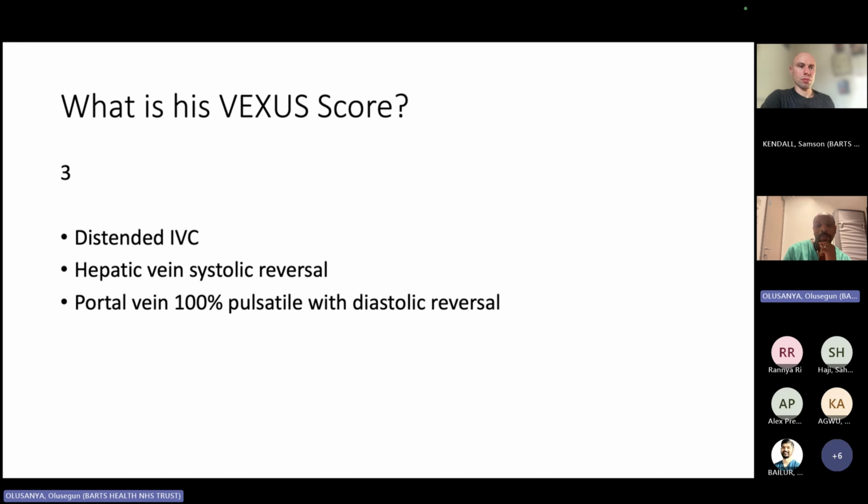Yeah, I mean, yes, definitely some of the views, especially in some of the intubated patients or bigger patients. Yeah, it can be quite hard to get, especially the renal, as you've put there. So in expert hands, this is William Beaubien-Souligny, who has basically written half his PhD on VExUS and wrote the paper. Him and André can get renal views in 75% of the patients. So you can expect to fail at full VExUS in a quarter of your patients.